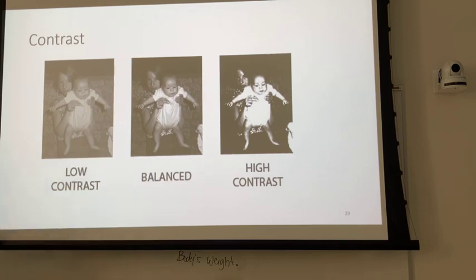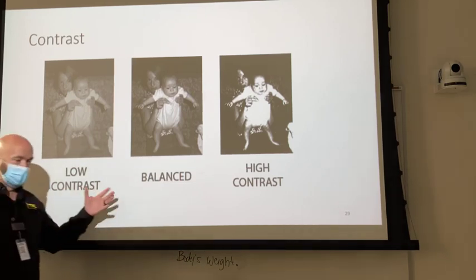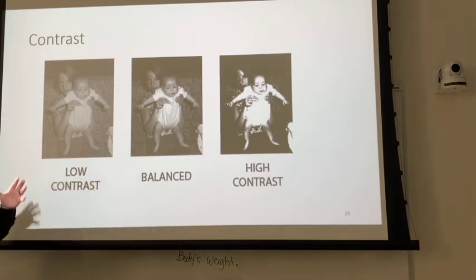So they're going to select, out of this list of possible perfect images, what it is that they want to see. And that becomes your lookup table for that particular exam.